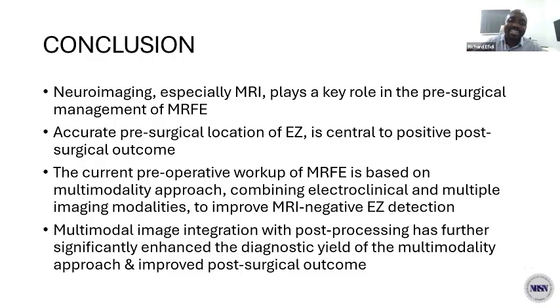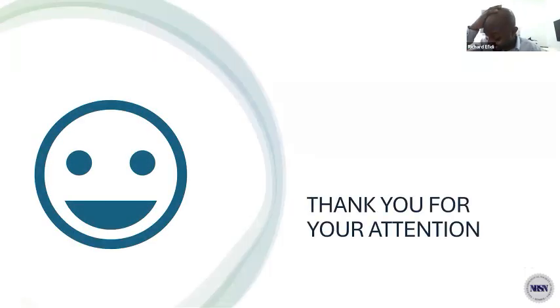The current pre-op workup of drug-resistant epilepsy is based on a multimodality approach, which combines electroclinical and multiple imaging modalities in order to improve detection of especially MRI-negative epilepsy. Multimodal image integration with advanced post-processing techniques has also enhanced the diagnostic yield of multimodality imaging and improved post-surgical outcome. Thank you for your attention.